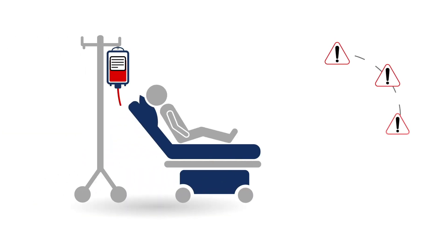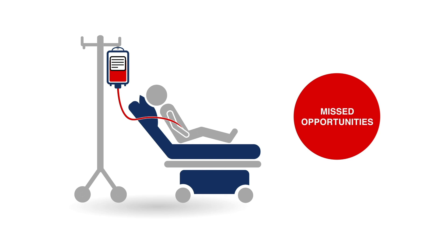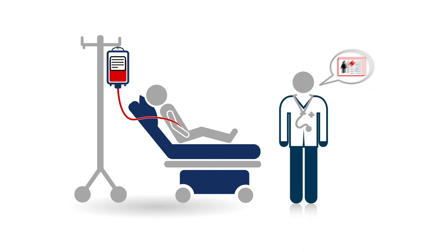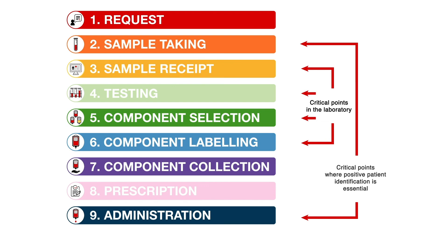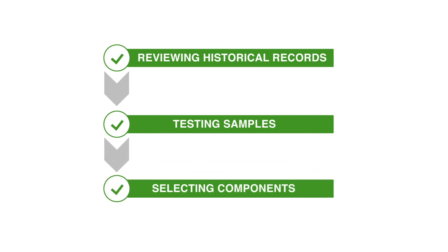SHOT has noted that many incidents are compounded by more than one error, where there may have been many opportunities to detect and correct the initial mistake. Effective communication and a solid foundation of transfusion knowledge, including patient-specific requirements, are key for all staff involved in transfusion. Many laboratory errors cannot be detected by clinical staff prior to transfusion; therefore, laboratory staff need to fulfill their responsibilities carefully when reviewing historical data, testing samples, and selecting components. Further information can be found at shotuk.org/resources/current-resources.